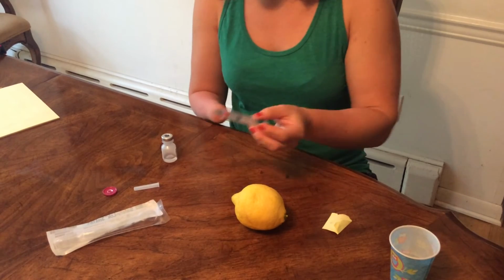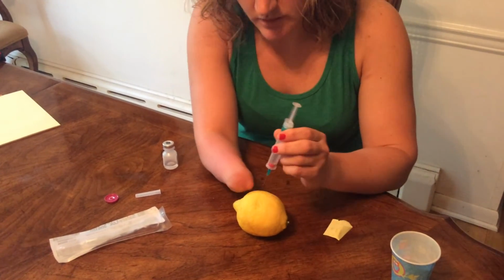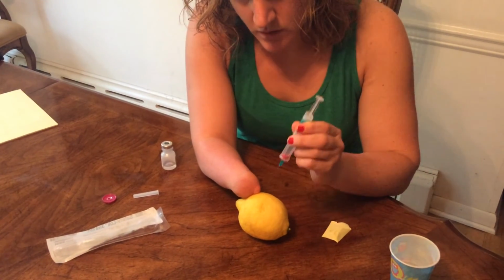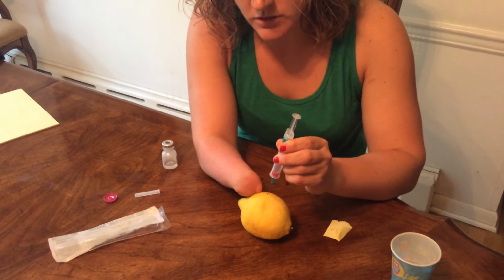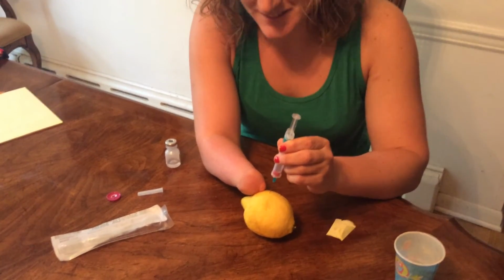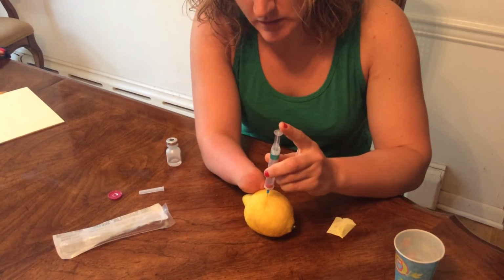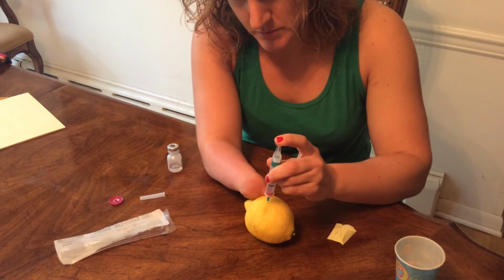So this is on nice and light, so you take it off. Okay, then a little hard when it's not an actual arm. You're gonna go a dart motion into the skin, okay? So obviously you would never really have your hand this close, but since I'm holding a lemon, it's a little different. So you have the area nice and clean, you're gonna go at it with a dart, sticking in the patient. It's kind of hard to get all the water in a lemon.